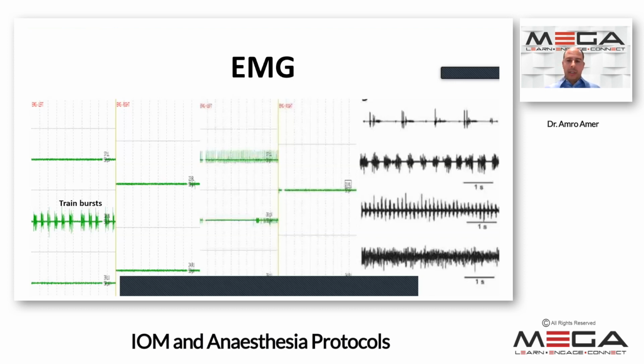Silent EMG is just a flat line of EMG. And if there's an irritation on the nerves, depending on what type of irritation, we can tell if the surgeon is retracting, if there's really mechanical injury, if there's stretch, or just manipulation.